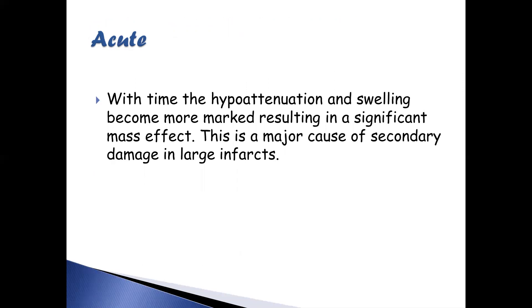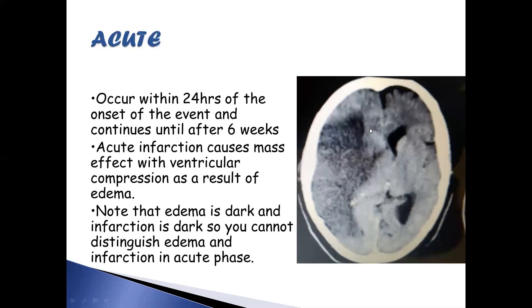This mass effect is a major cause of secondary damage in large infarctions. Acute infarction occurs within 24 hours of onset and continues until about six weeks. It causes mass effect with ventricular compression as a result of edema — you may see midline shift. Note that both edema and infarction appear dark on CT, so you cannot distinguish them in the acute phase.